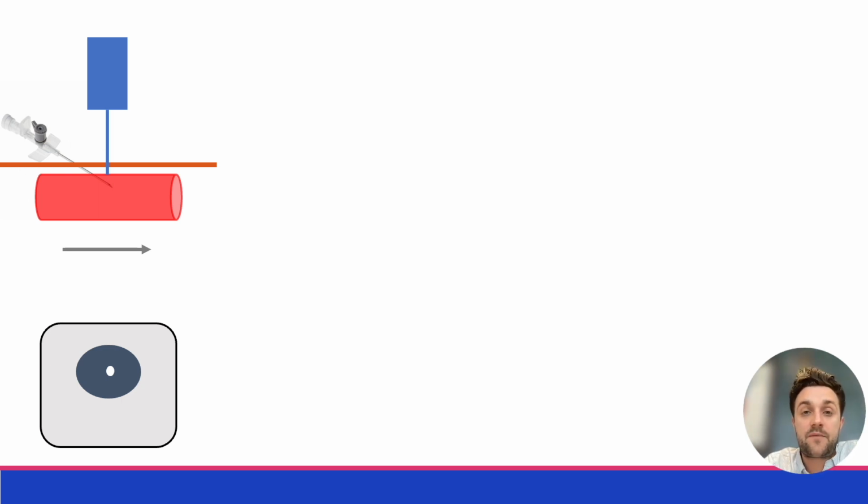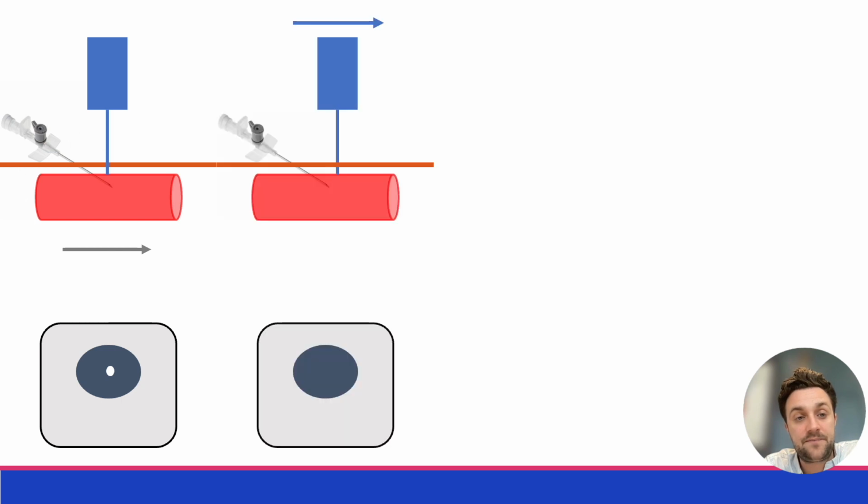So we're going to do that from the moment that the needle enters the skin. This diagram just highlights it within the vein. You can see here that we've got our bullseye sign, that the probe is looking at the needle and the needle is in the vein as highlighted by this, but we're not sure if this is the tip. So in this case, we keep the needle perfectly still. We advance the probe just until the white disappears, and we're talking millimeters at a time here. The less movement, the more accurate you can be.